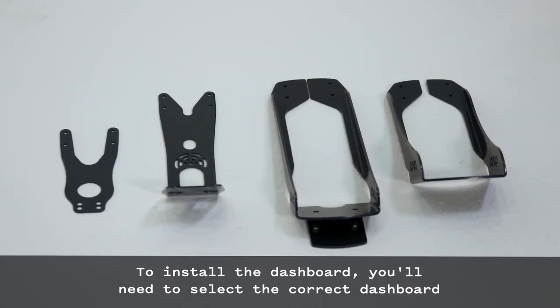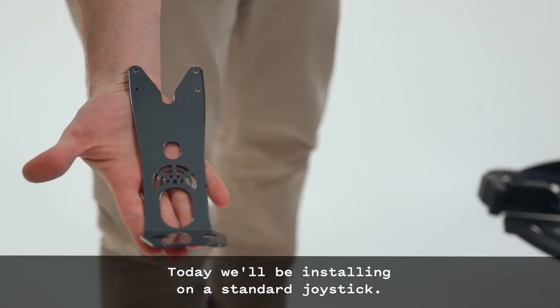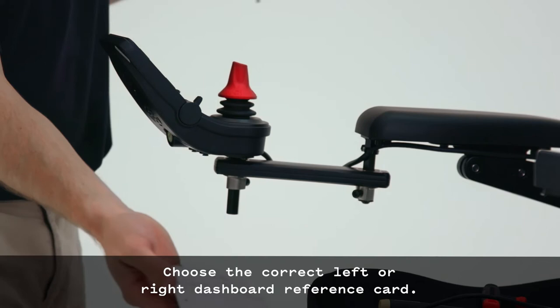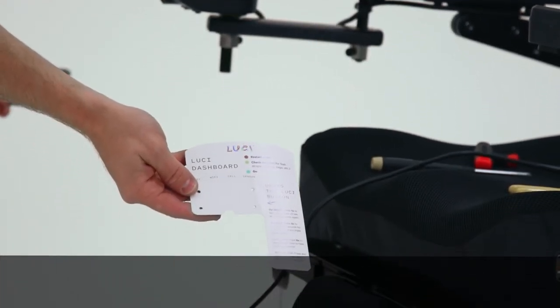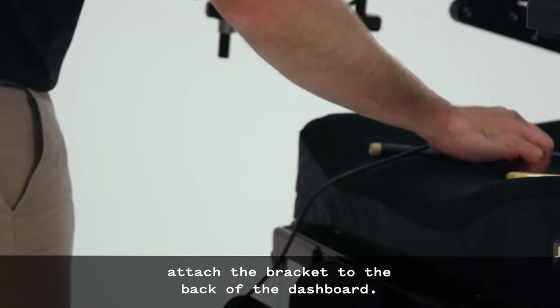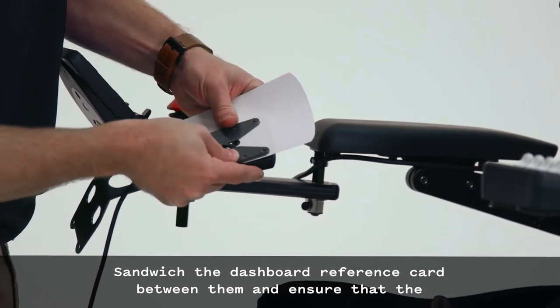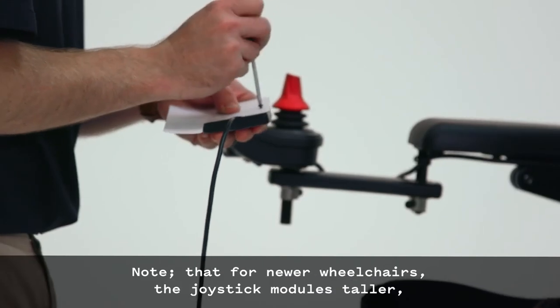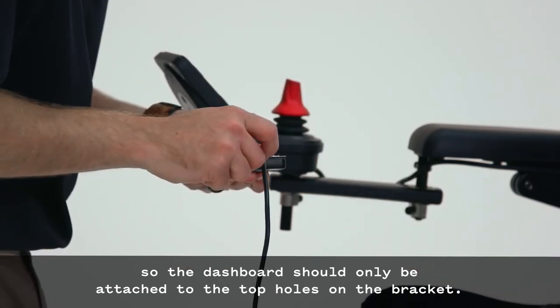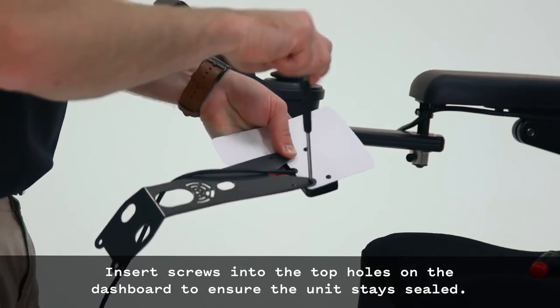To install the dashboard, select the correct dashboard bracket depending on the wheelchair's drive system. Today, we will be installing on a standard joystick, also known as a CJSM joystick. Choose the correct left or right dashboard reference card. Use four 4-40 x 3/16-inch screws to attach the bracket to the back of the dashboard. Sandwich the dashboard reference card between them and ensure that the cable is routed correctly. Note that for newer wheelchairs, the joystick module is taller, so the dashboard should only be attached to the top holes on the bracket. Insert screws into the top holes on the dashboard to ensure the unit stays sealed.